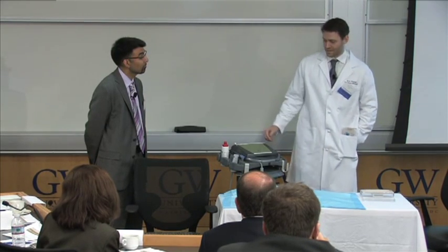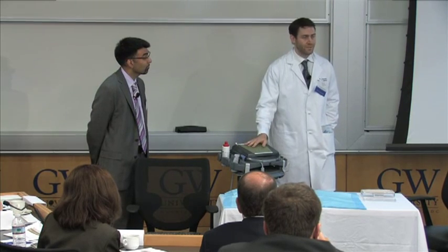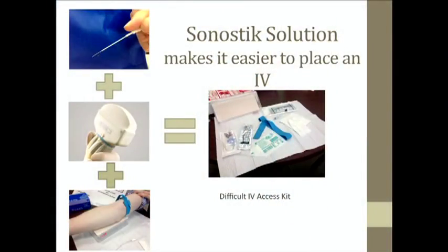And we did it using the assistance of ultrasound here, which is supposed to help you distinguish between arteries and veins. We went into an artery, and this caused the patient to have their limb lost when the medication went into the wrong place. With that case, and there are many others, 15% of catheters have complications. And so we came up with these new innovations. So the first is an improved catheter and catheter introduction set. The second is a probe cover. And the third is a positioning tool and kit, which then puts everything together.